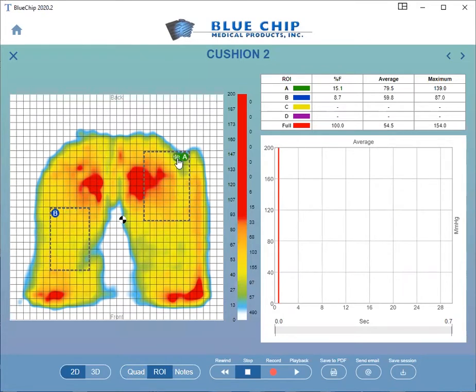Mousing over the region of interest — for example, Region A — reveals the option to delete.